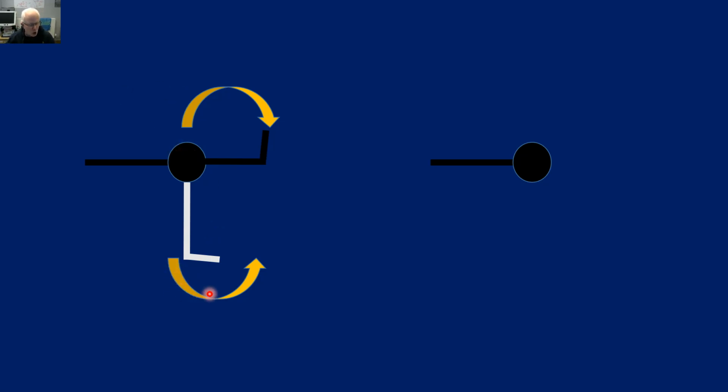So if we're pushing the dynamometer arm, going from flexion to extension, the dynamometer in this example is applying a resistance in the exact opposite direction. You're pushing, it's pushing back against you. In that scenario, that is referred to as concentric extension. So the limb has gone from flexion to extension. But remember that under concentric loading, we get a shortening of the muscle. And you'll see, perhaps when we show you this eccentrically, the absolute distinction in terms of the way this works.